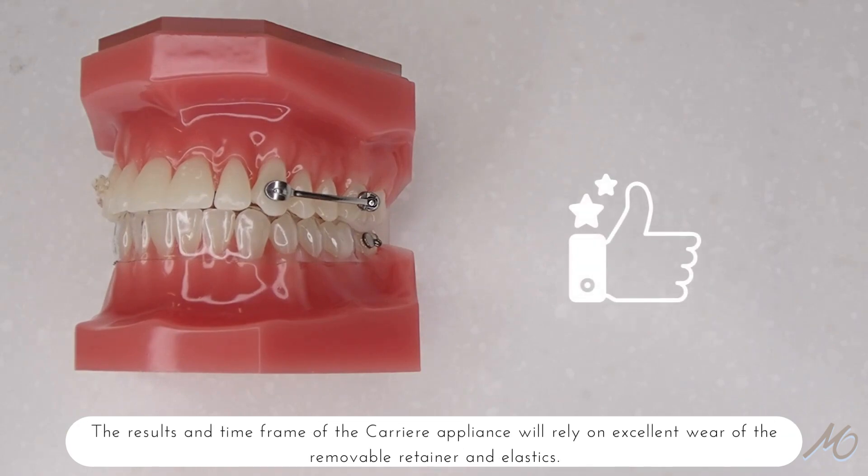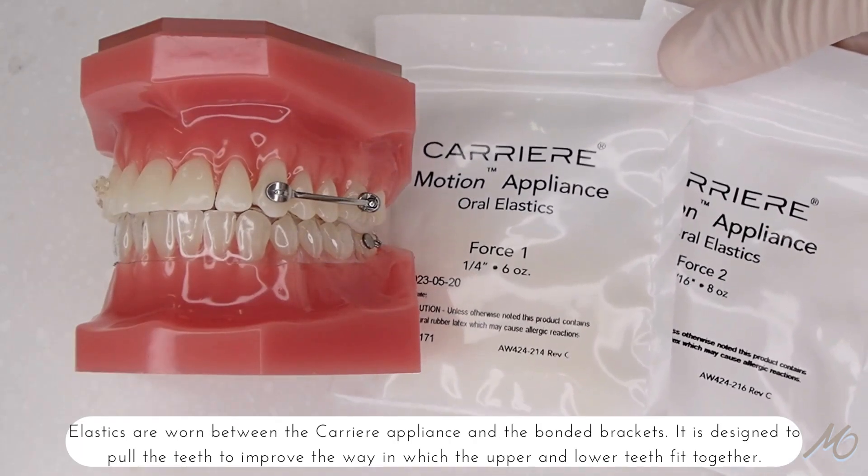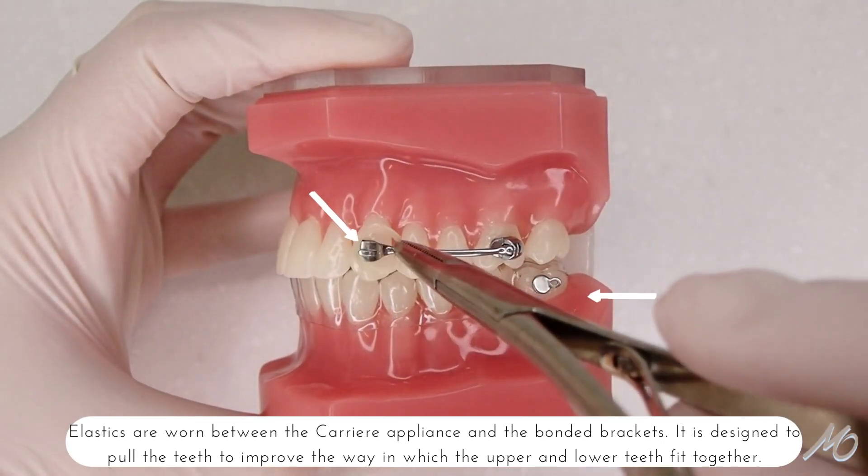The results and time frame of the Carriere appliance will rely on excellent wear of the removable retainer and elastics. Elastics are worn between the Carriere appliance and the bonded brackets, and are designed to pull the teeth to improve the way in which the upper and lower teeth fit together.